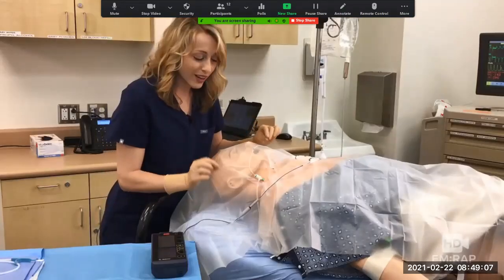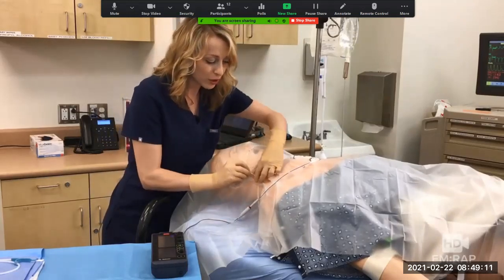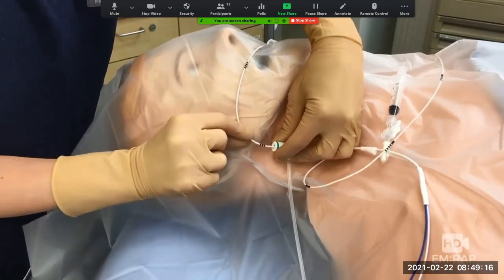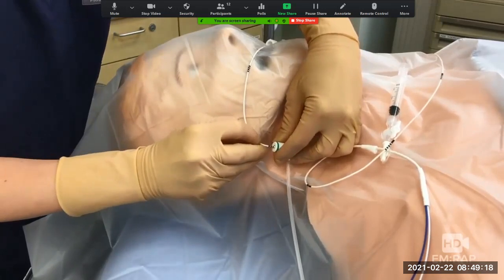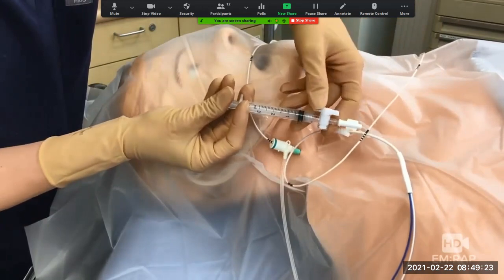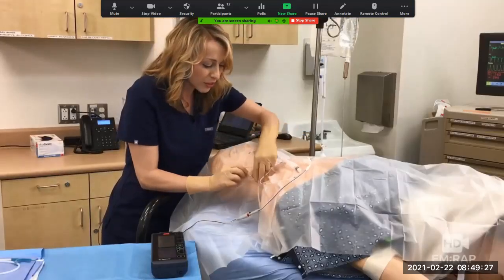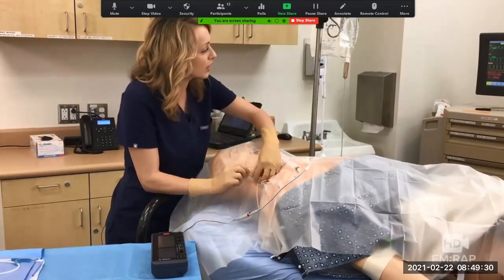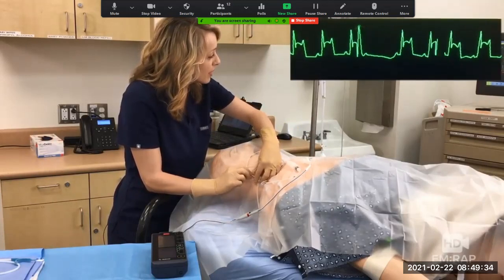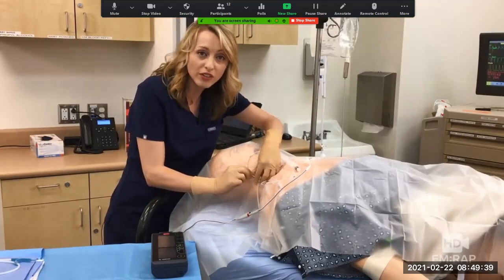Now we're going to insert the wire a little bit further so that we can float the balloon in. So we're going to push that wire down to the 30 centimeter mark, which of course is indicated by the 3 black lines on the pacing wire. Now it's at 30 centimeters, and I'm going to go ahead and inflate that balloon. And now, probably another 5 centimeters or so. And as I do this, I'm looking at the cardiac monitor, and I'm looking for that injury pattern that looks like a STEMI in lead V1. That's it right there. And you could confirm this on ultrasound if you have it.